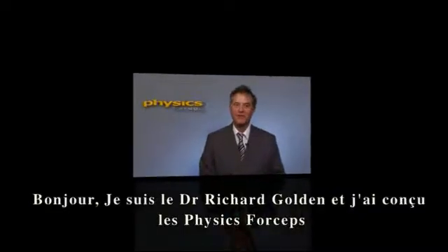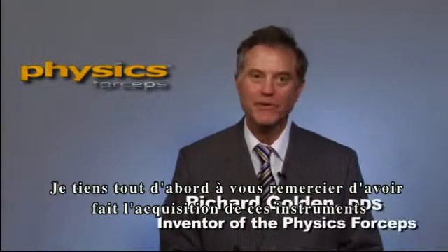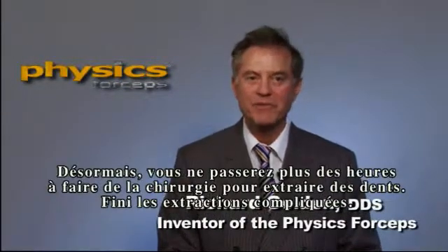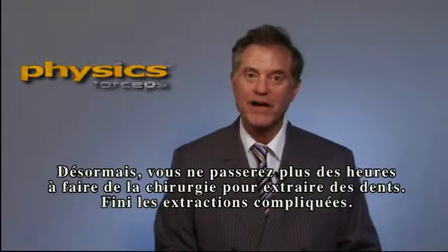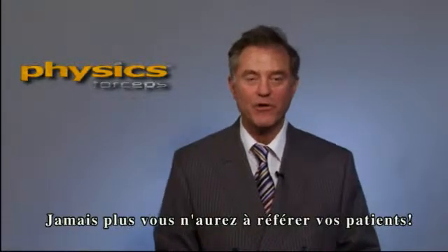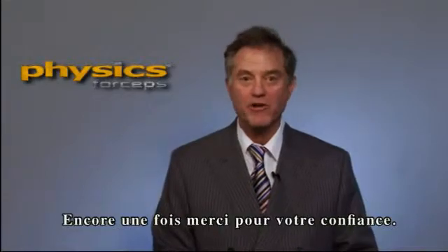Hi, I'm Dr. Richard Golden, inventor of the physics forceps. I'd like to take this opportunity to thank you for buying a set of the physics forceps. The days of laying flaps, doing surgery, and taking up to one hour to take a tooth out are over. The days of referring difficult extractions are over. Again, I'd like to thank you very much for buying a set of these remarkable instruments.